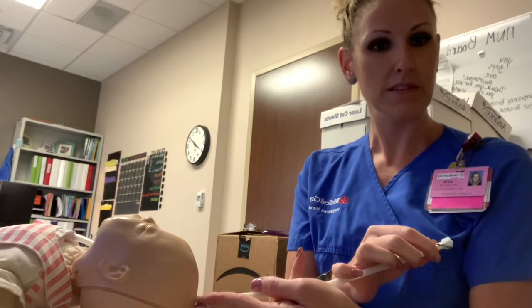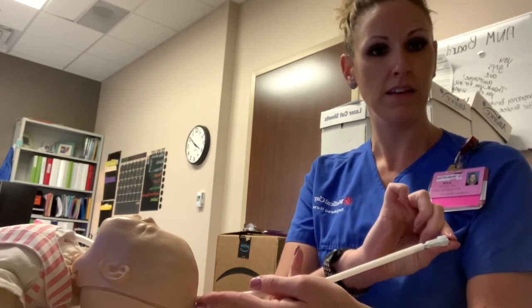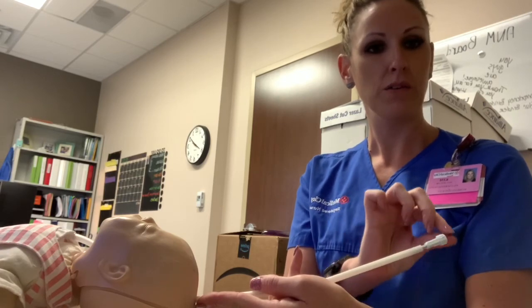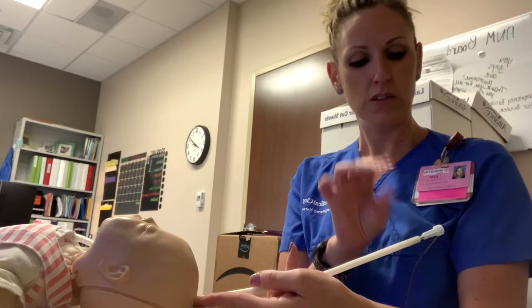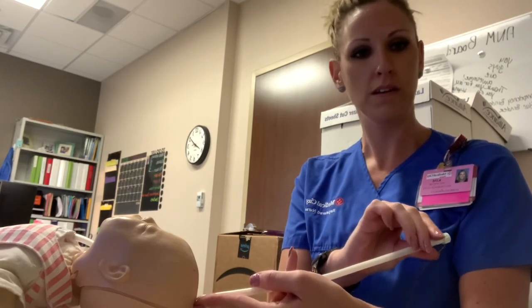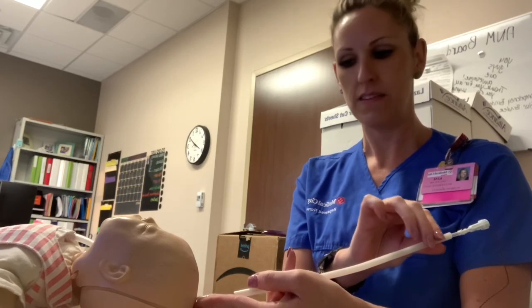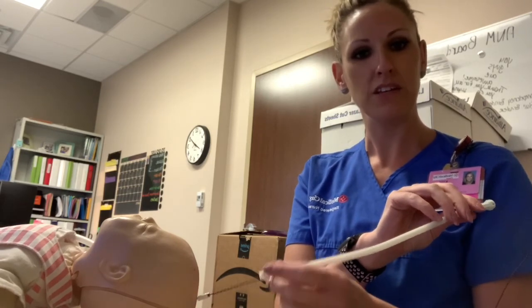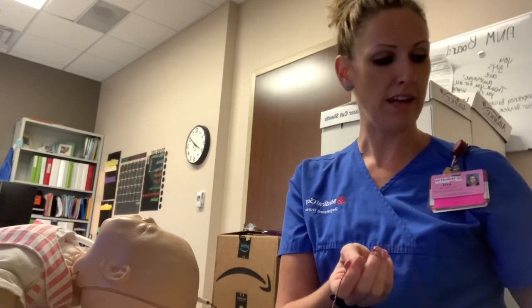And if you can see, resistance is met when it turns back like that. We're going to unlock it, like that. We're going to test it, pull very slightly, so now the electrode is in place. So I can go ahead and I can pull the guide and the sheath out. And as you can see, it is attached to the fetal head. So you can pull this out of the vaginal canal now.